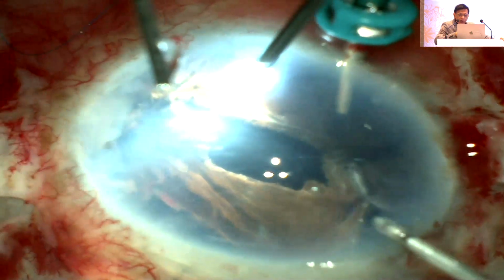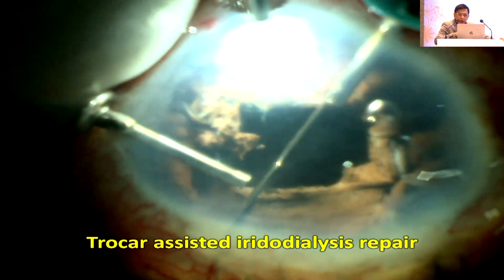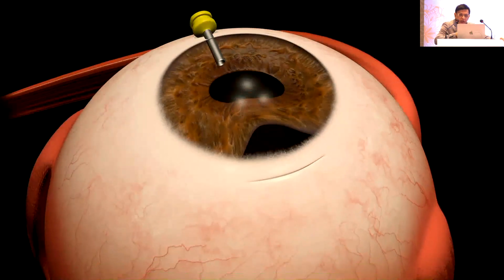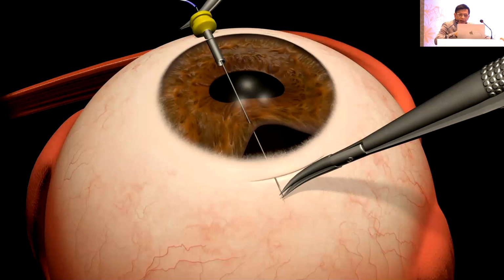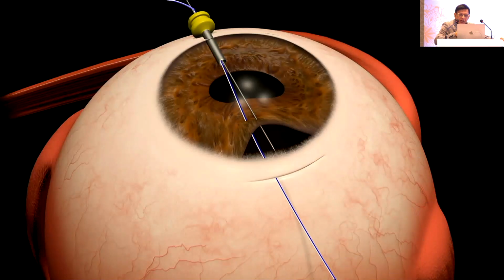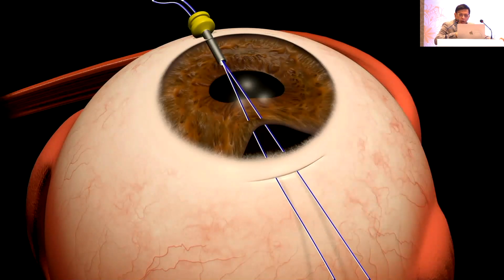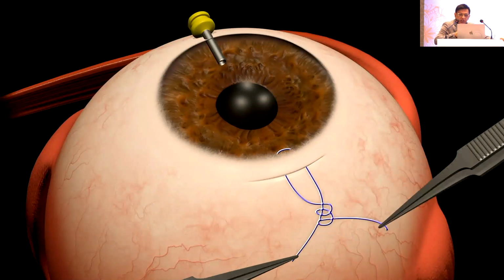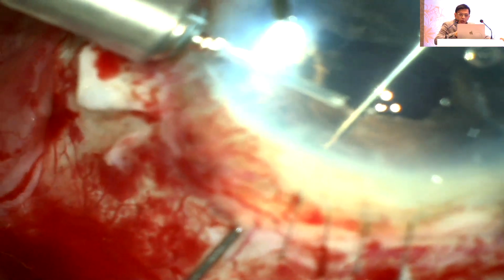You can see my Purkinje image is centered, but there's an iridodialysis there. So I use the trocar-assisted iridodialysis repair which we published. Basically, it fixes a trocar right opposite the iridodialysis. Double-arm Prolene needle. You see, pass one, pass the other, pull. Once you pull, you tie, and you clear up the iridodialysis. So that's the way to handle iridodialysis.